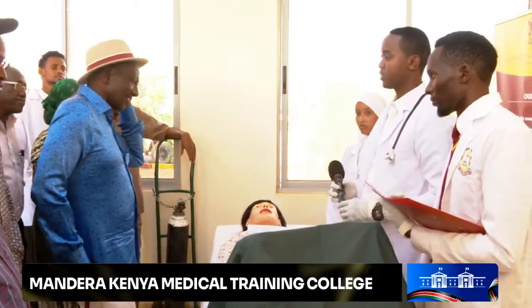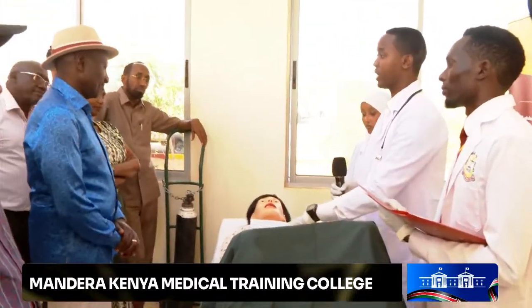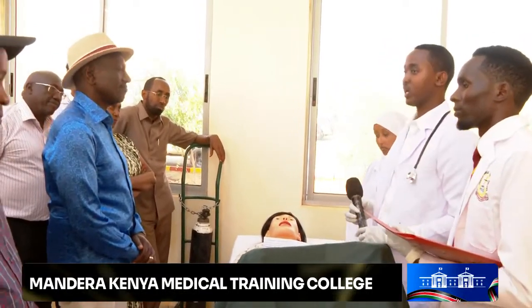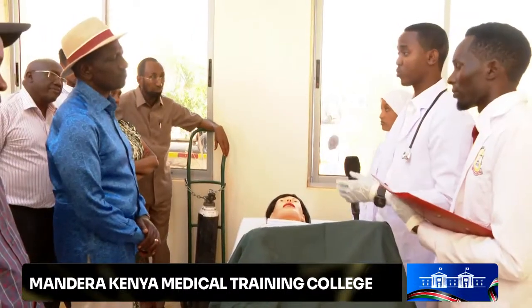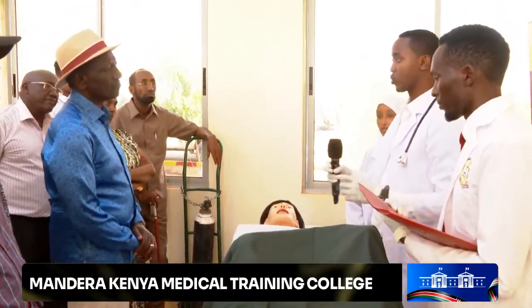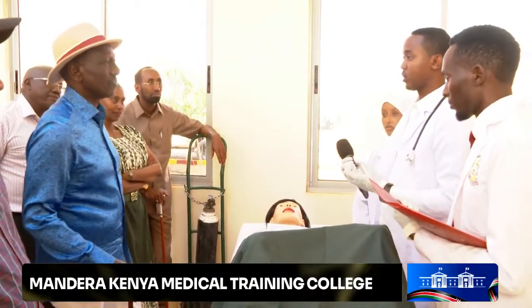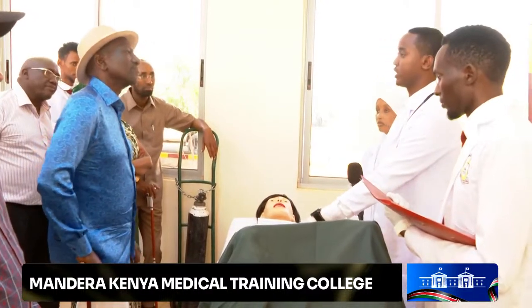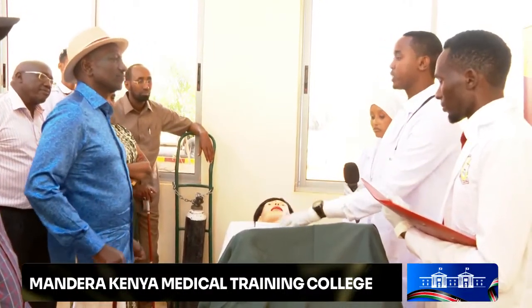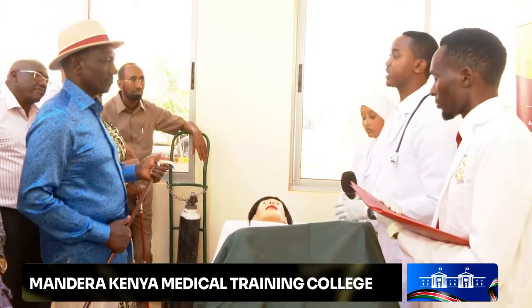that I will use. Before you is a patient with a problem of bladder incontinence, maybe as a result of a health-related condition, or even a growth within the routes that the urine passes. They may get obstructions, and this will lead to urine accumulation in the bladder. So when a patient develops such conditions, we have a procedure for them, and that procedure is catheterization.